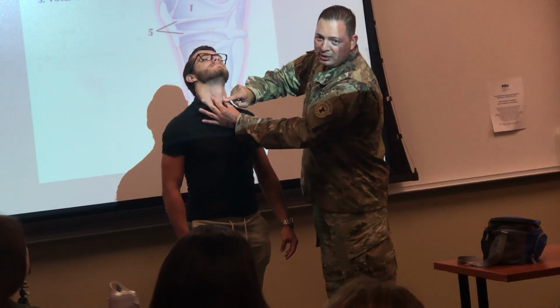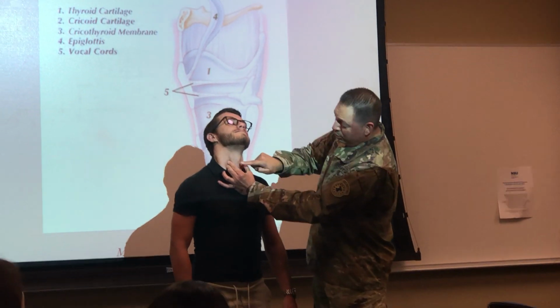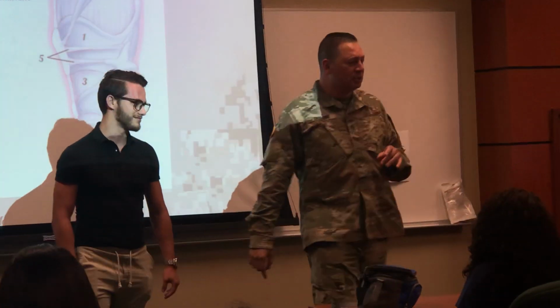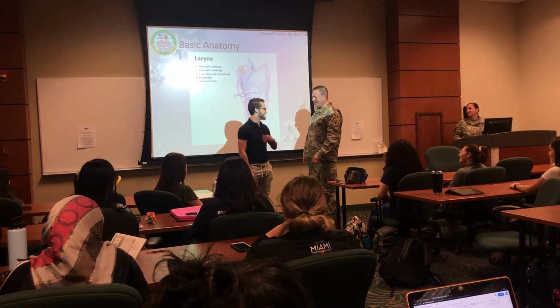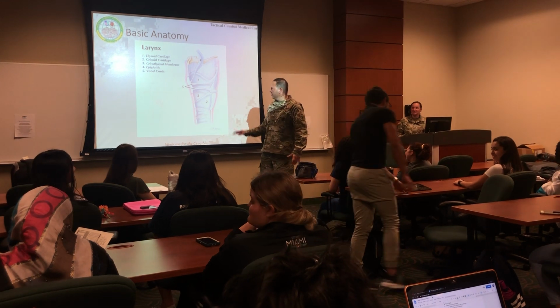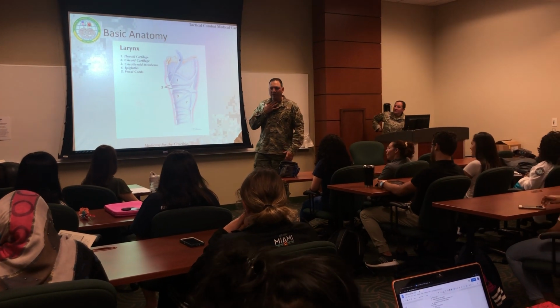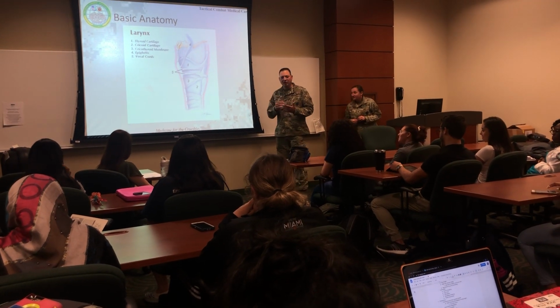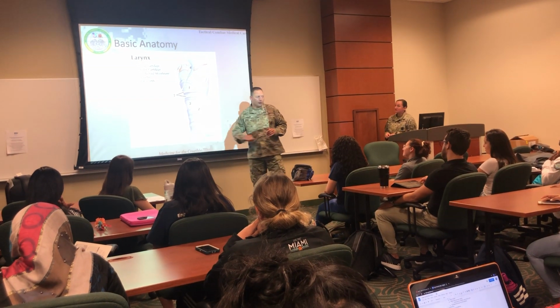I'm actually palpating his carotid arteries right now, so it shows you just how close that is and how careful you have to be. I'm gonna show you exactly how to insert the scalpel so that you don't, can you feel that when I put pressure on your carotid? So other than that, like I said, it's very important to be able to identify. Not everybody will have a nice size Adam's apple for you to do this, so you're gonna have to be able to palpate and to be able to make sure you identify your appropriate landmark.